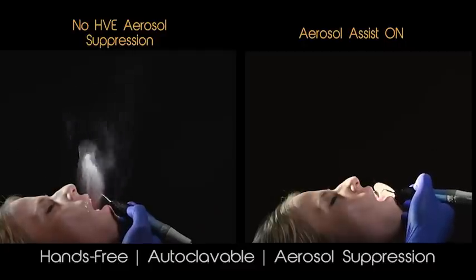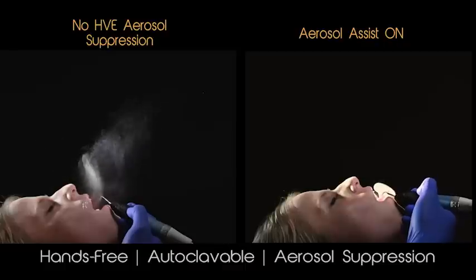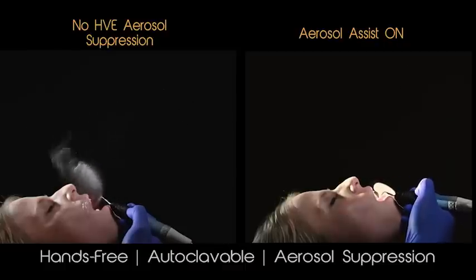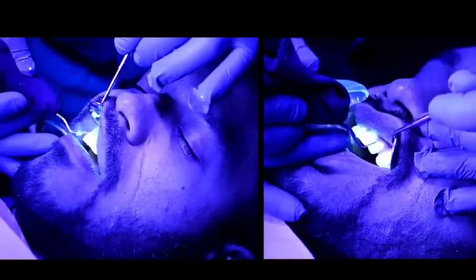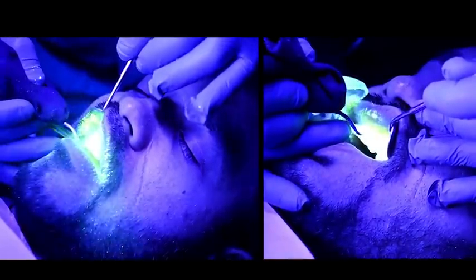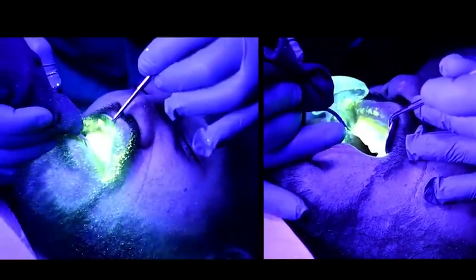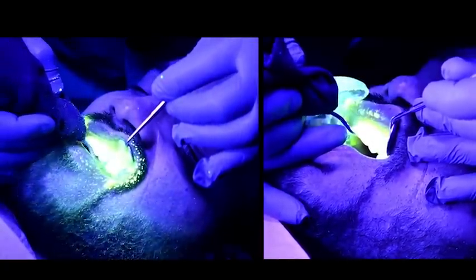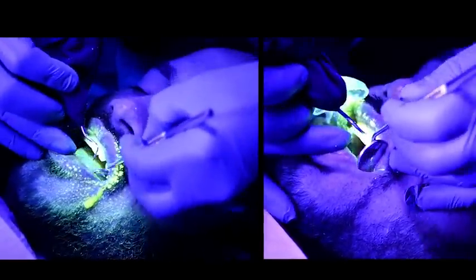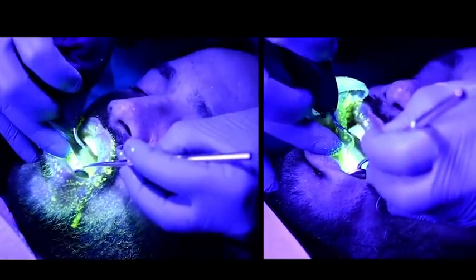On the left, the patient has more splatter visible, and you can see the change of direction of those aerosols from the scaler as the patient breathes. This is something that is not easily visible to the naked eye with normal lighting. In this splatter visualization testing, we use a non-toxic fluorescent dye. It is run through the scaler, and then we flooded the operatory with black lights in order to more easily visualize where the aerosols are accumulating and to see if we were effectively doing a great job in reducing them.